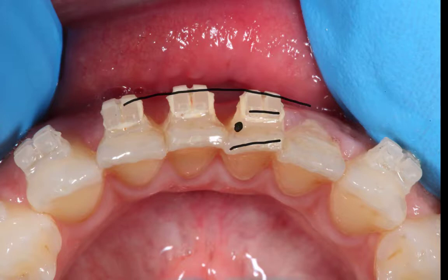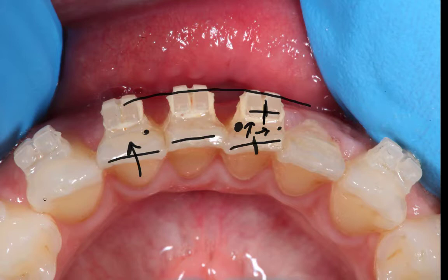It seems like there's probably a little bit of extra composite there. Also, this is the middle of the tooth here, and this bracket slot is not in the middle — so the bracket is off to one side a little bit, but it's also rotated out that way a little bit. And you can see that even this bracket positioning here isn't ideal. There's a little bit extra there, which means the bracket is not in perfect line with that incisor. And also this canine tooth — the incisal edge is there, but there seems to be a little bit of extra composite, and the bracket is a little bit distal there.